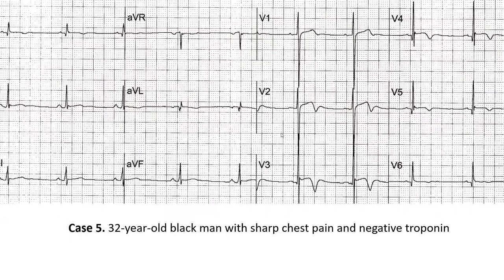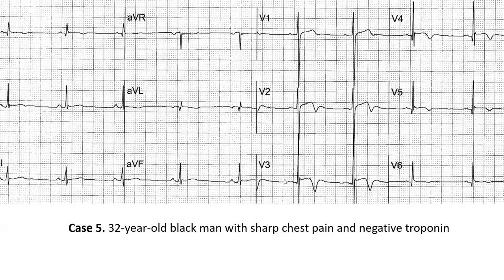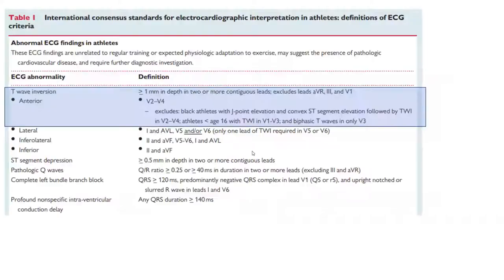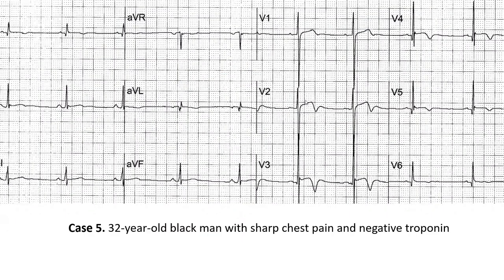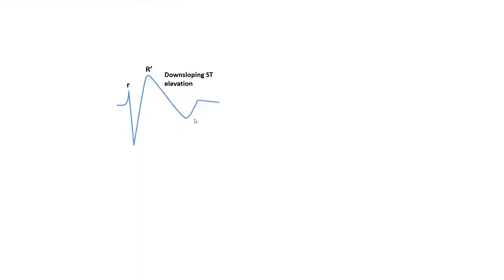Another differential to consider, especially in a young athlete at pre-participation screening, is Brugada. The shape doesn't fit here — Brugada ST elevation would be downsloping, a coved ST elevation, not this shape. So the differentials are: early repolarization variant, HCM, ARVD, Wellens, and Brugada.